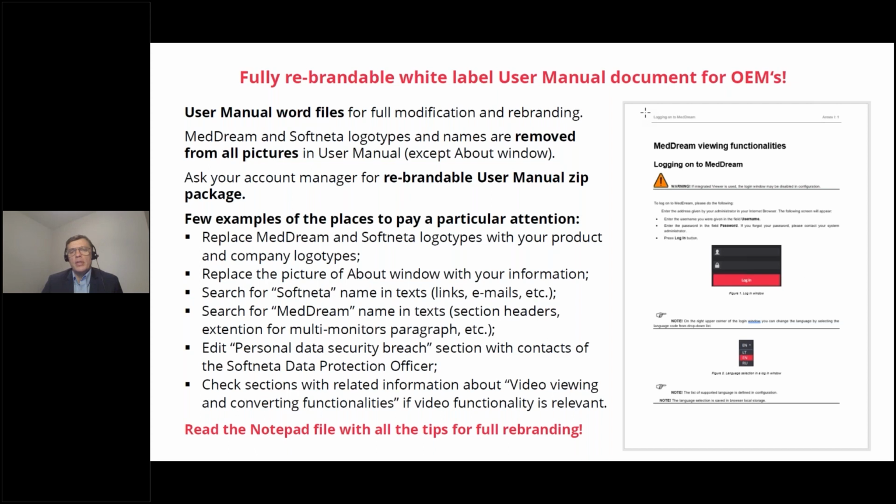Yes, the changes will definitely be significant in the next release, because as you know, or if not, you will be informed, in many cases of rebranding you will need to leave the original product name for traceability. In the past this was not mandatory, but now it has become mandatory. So we are designing a new About box, and everything will be placed in this document. You need to really keep an eye on that documentation, because on the change you will also be obliged to change your branding options, because this is important for traceability and avoiding any misunderstandings.